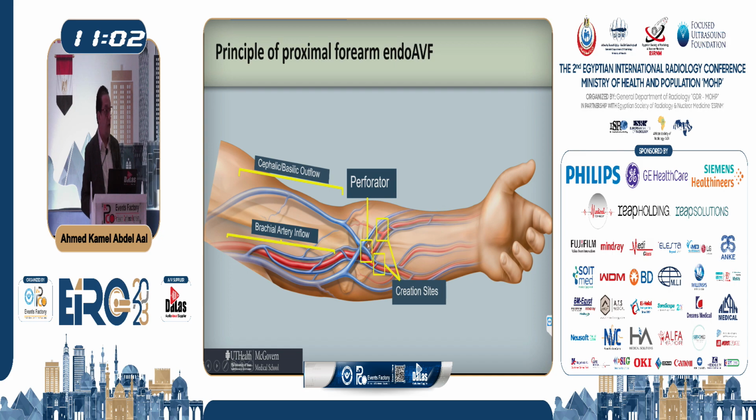So if the patient does not have this perforator, which happens in 20 to 30% of the patients, you cannot create that fistula. So this is really essential.